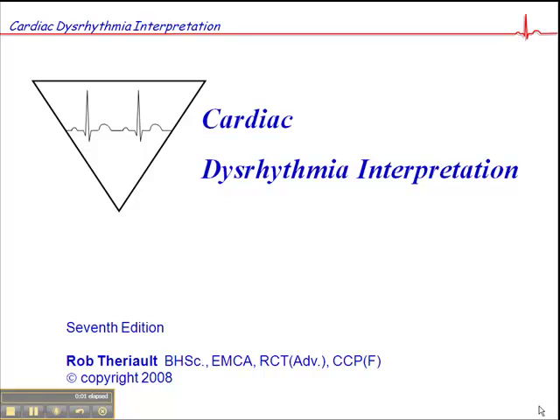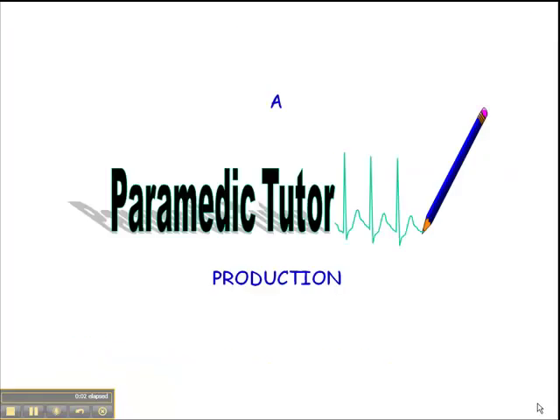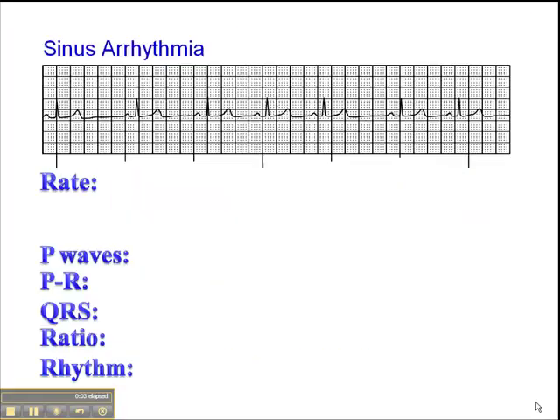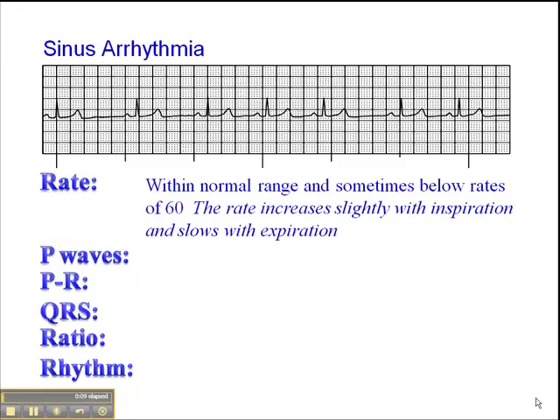This next rhythm is on page 50 of the Cardiac Dysrhythmia Interpretation Workbook. This is a sinus arrhythmia, a rhythm in which the heart rate varies with the respiratory pattern.